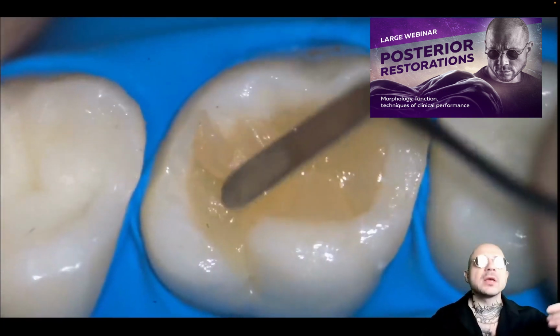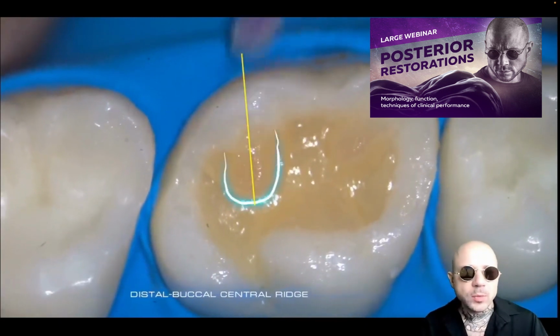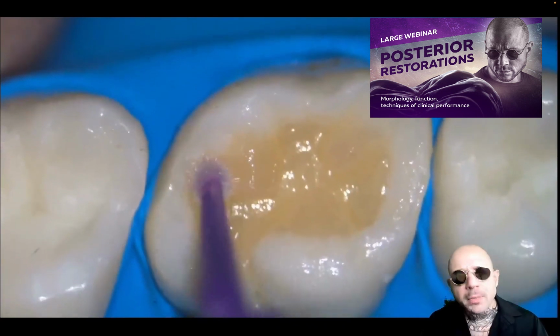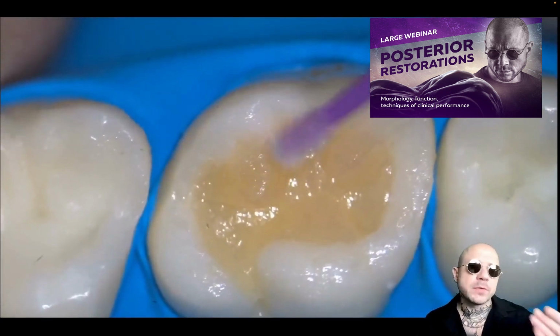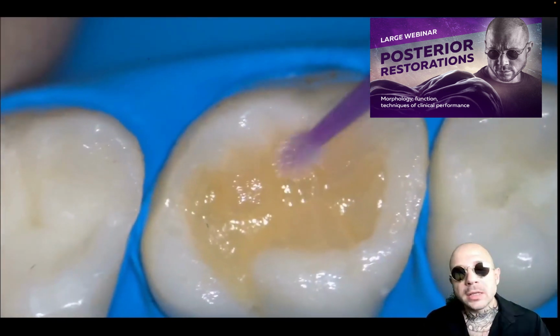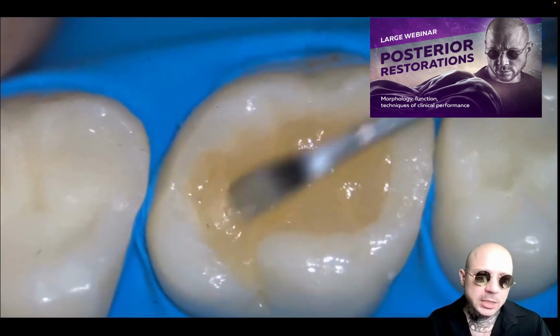Then if the excesses were too significant, we need to remodel or remove them, and then it would be better to repeat this procedure once again, and the final volume will be adjusted quite precisely.